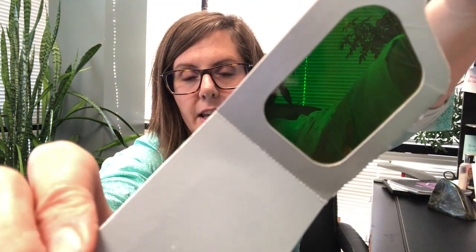What we're going to do is use photosyntonics, or syntonics, also known as light therapy. This filter is actually utilized for someone who has an eso-turn of the eye or an esotropia. With this, we have you wear these glasses for a specified amount of time daily. You look at a light source and it starts to electrically trigger the muscles around the eyes to pull the eyes out into a straight pattern rather than crossing them in.